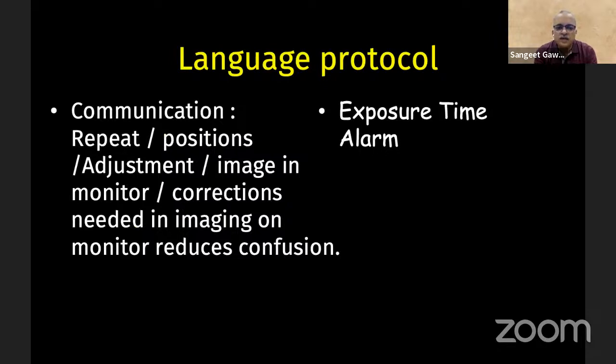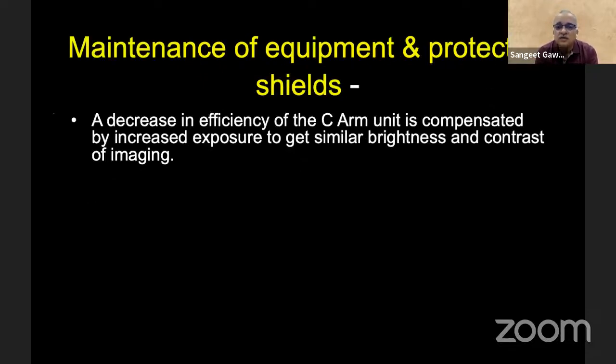So communication should repeat the position, the adjustment, the image in the monitor, and the correction needed in the imaging and the monitor, which reduces the confusion between the OT personnel. Exposure time should always be checked by somebody. You can train your technician to watch the exposure time and inform the surgeon, because most of the time we are so engrossed in the surgery, we are unaware of what the exposure time is.